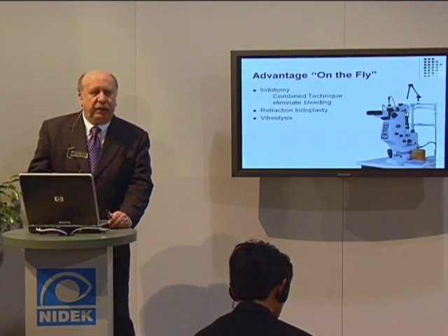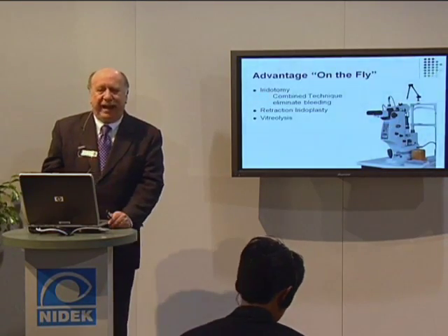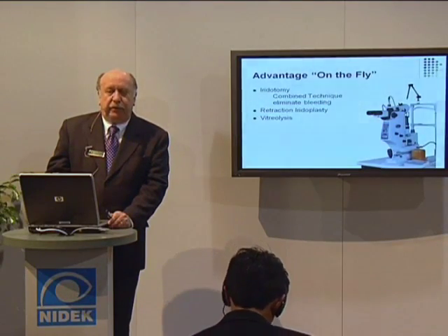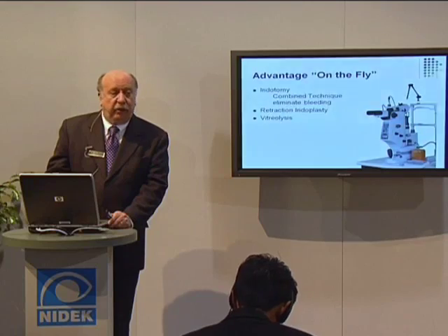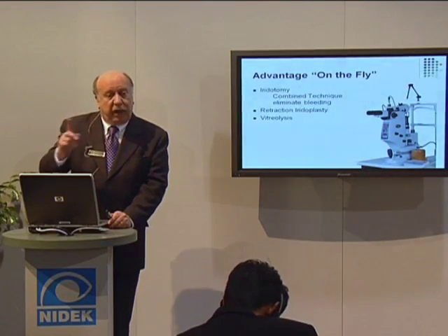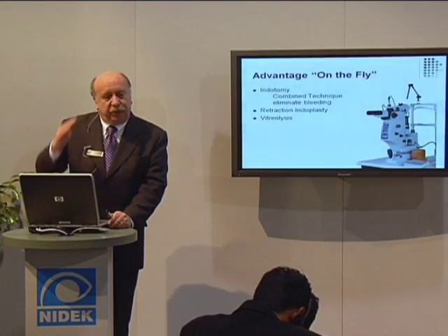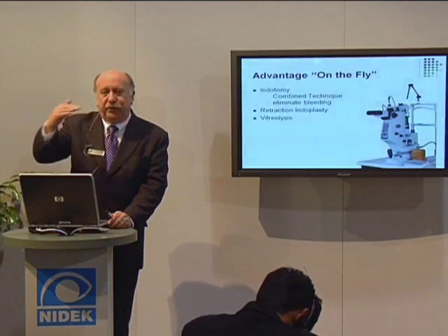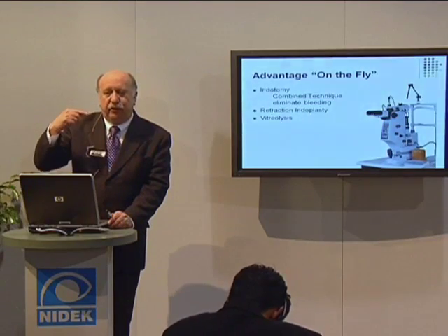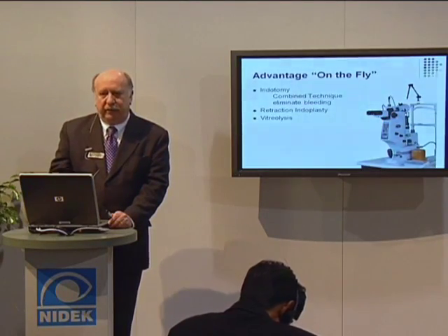Iridotomies are now being done more often. They call them prophylactic iridotomies for narrow angle glaucoma, narrow angles, just period. They will do an iridotomy, and they do them at 11 o'clock and 1 o'clock, so that when you're driving at night, you don't see the car headlights coming through those holes, because your lid drops when you're driving.